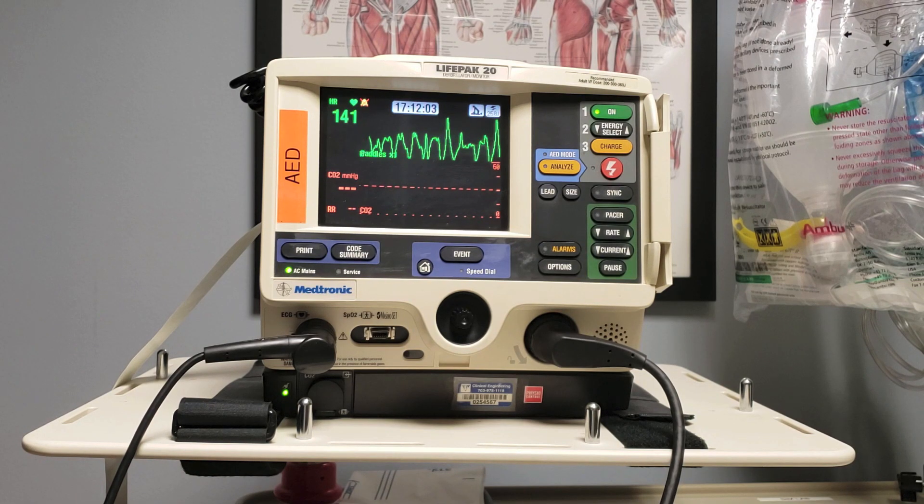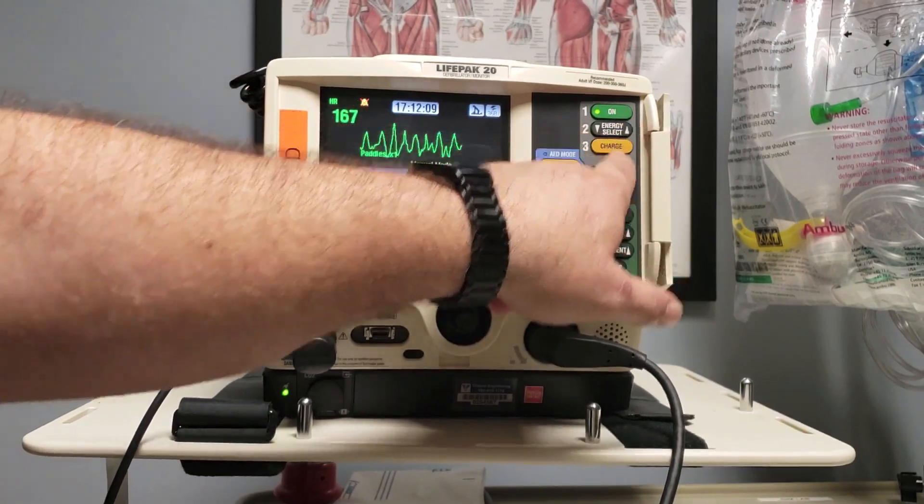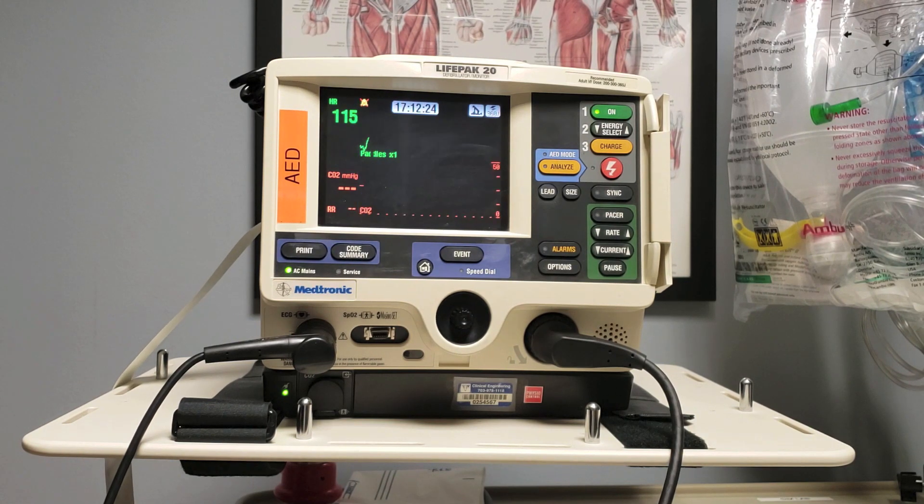We're still in V-fib and the provider is asked to go to the maximum of 360 joules. Charging to 360. Charging. I'm clear, you're clear, we're all clear. Energy delivered. And that is how to defibrillate a patient with the LifePak 20. Please let me know if you have any questions. Thank you.